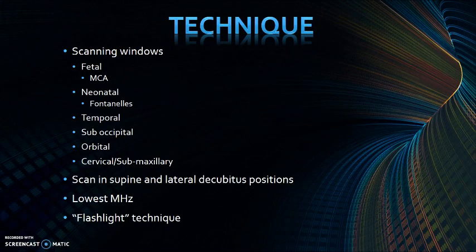All right, so let's go over scanning windows. We do Dopplers also on fetuses for the MCA to rule out growth restrictions. On them, you just scan the middle cerebral arteries bilaterally, and you use a biparietal diameter type window, transverse at the base of the skull. In neonates, we use the fontanelles, and we also use the temporal bone. On children and adults, we use the temporal, the suboccipital, which is also called the transforaminal, the orbital through the eye, and the cervical or submaxillary window.